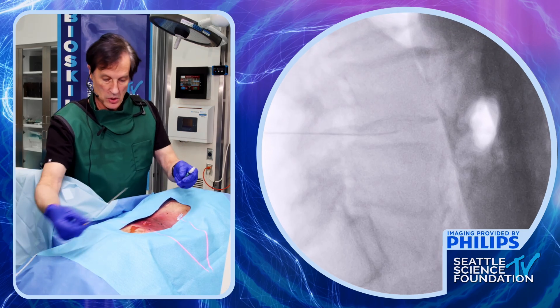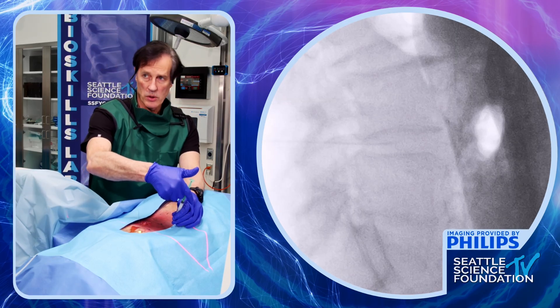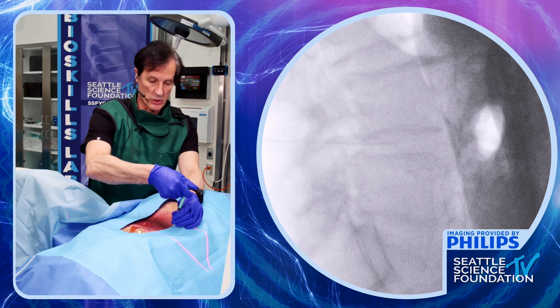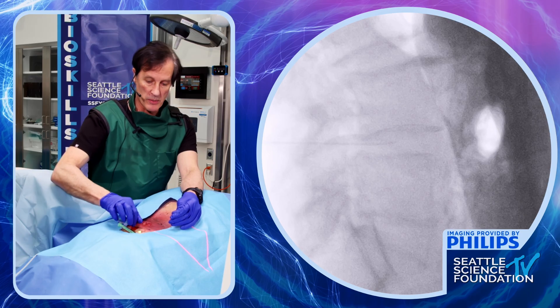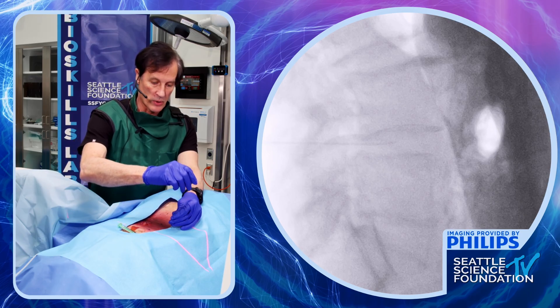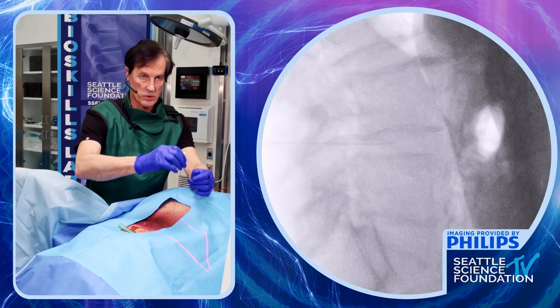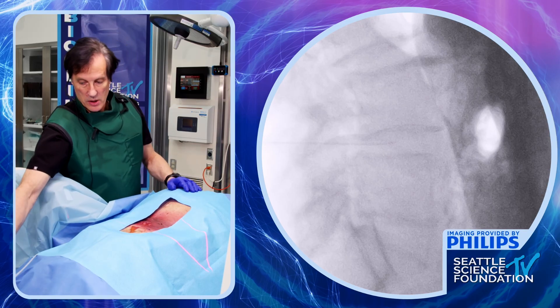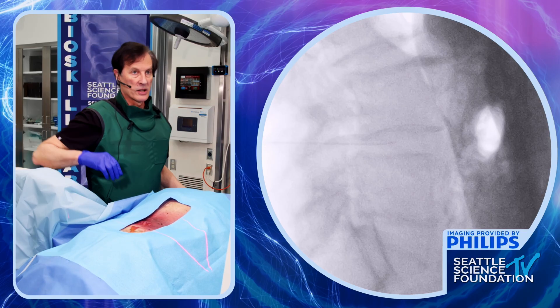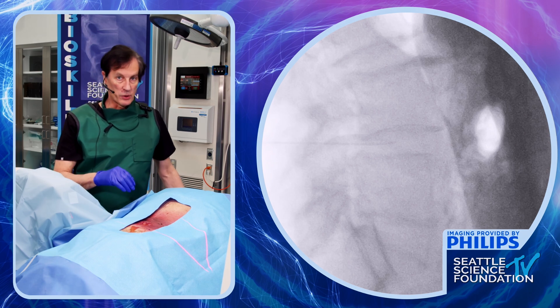We'll inject this — take a picture before. I'm going to inject the material; take a picture now so you can see the disc pop up. The vertebral end plates pop up. Style it back in to evacuate the rest of the disc material, then pull it out. And that's all there is to it — that is injection of micronized disc material by Vivex. Any questions or comments? Thanks, Doug — that went great.